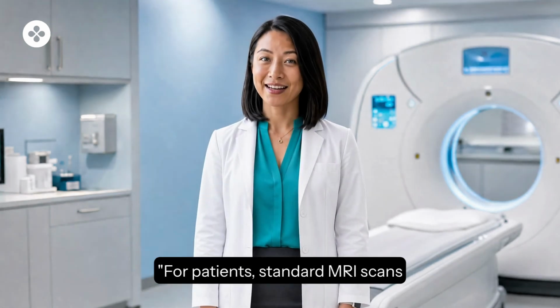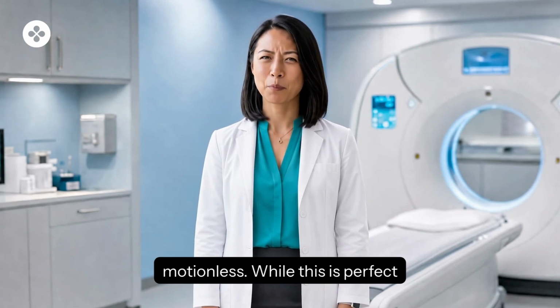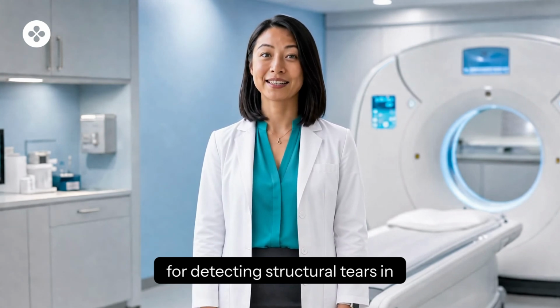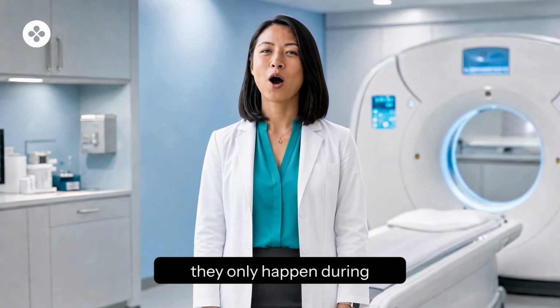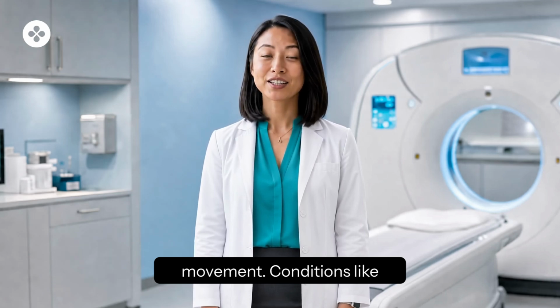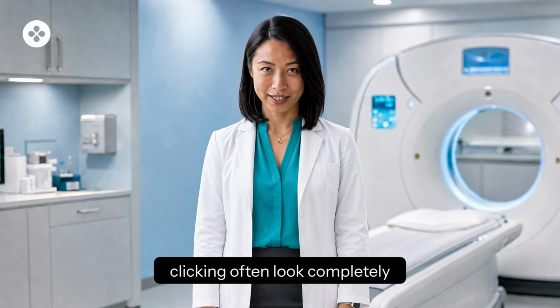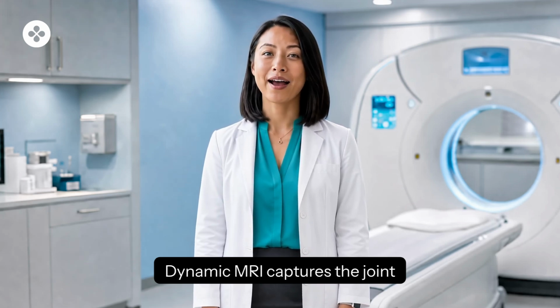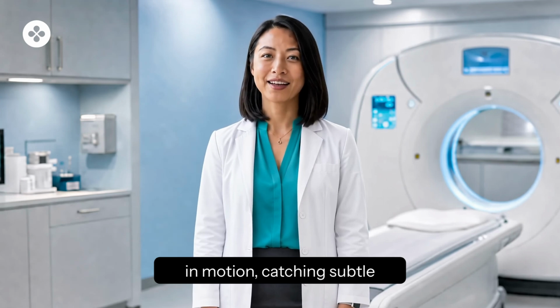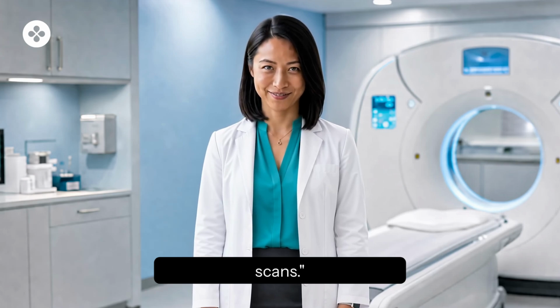For patients, standard MRI scans are taken while you lie flat and motionless. While this is perfect for detecting structural tears in ligaments or tendons, some joint problems are dynamic, meaning they only happen during movement. Conditions like patellofemoral instability, shoulder impingement, or joint clicking often look completely normal on a resting scan. Dynamic MRI captures the joint in motion, catching subtle subluxations and tissue pinches that stay hidden during still scans.